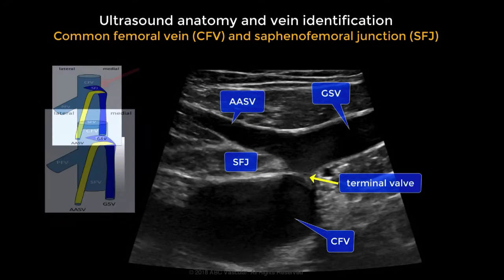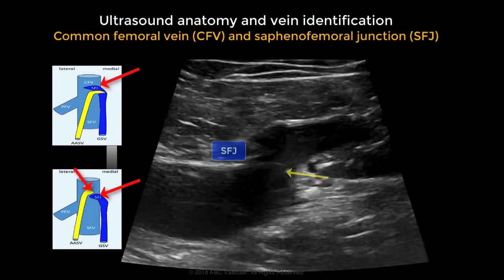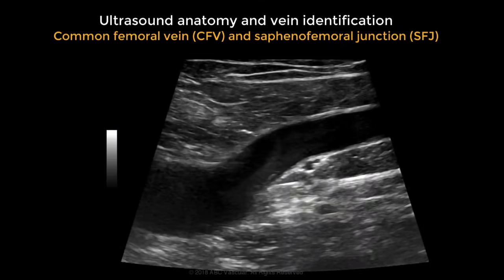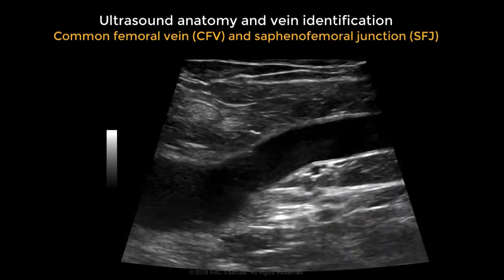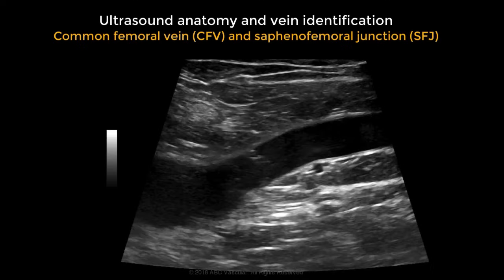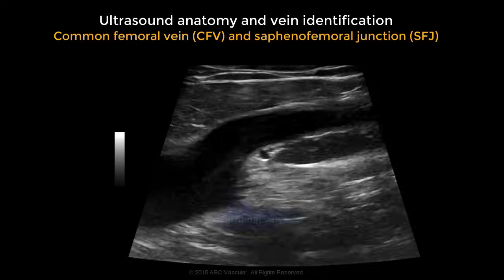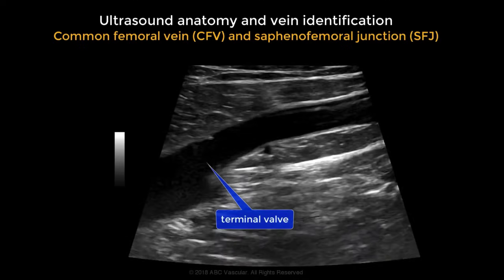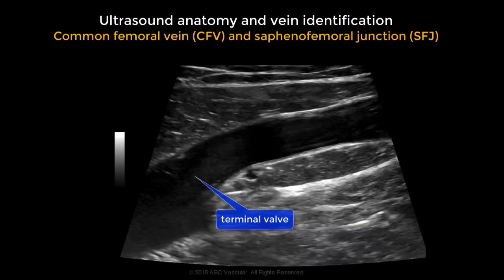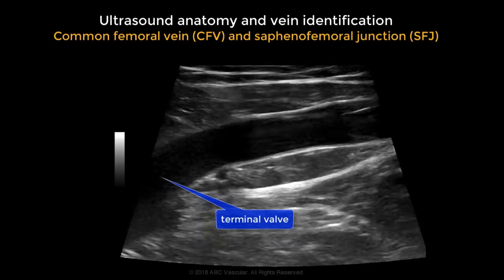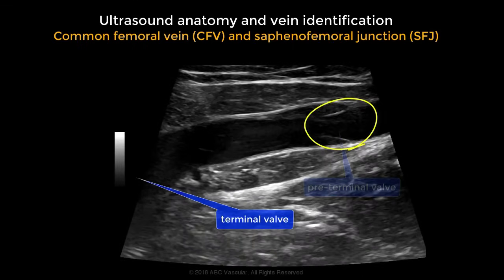These two veins can share a common origin or they can have a separate one. If we focus on the great saphenous vein, we can see the terminal valve here, and by moving the transducer in longitudinal view further down we can identify another valve — the preterminal valve.